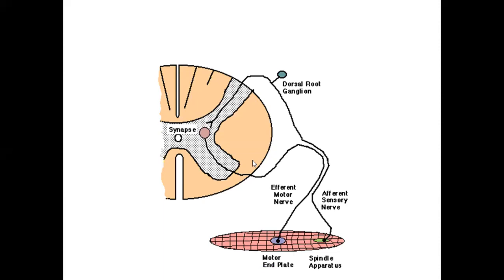This is the picture. This is transverse section of spinal cord. In each half, we can see the gray matter. In the gray matter we have posterior horn and anterior horn, and this is gray commissure that connects the gray matter of the right and left side. And in the sacral region, we have these lateral horns, and also in the thoracic and upper two lumbar region, we have lateral horns for the autonomic nuclei. So this is the posterior horn, and this is the anterior horn.